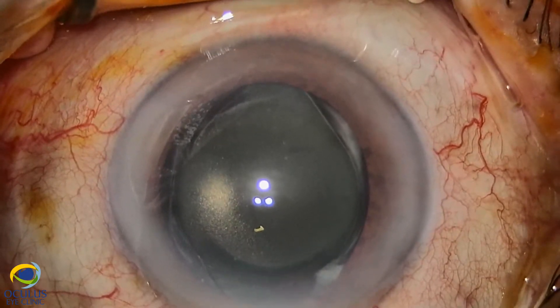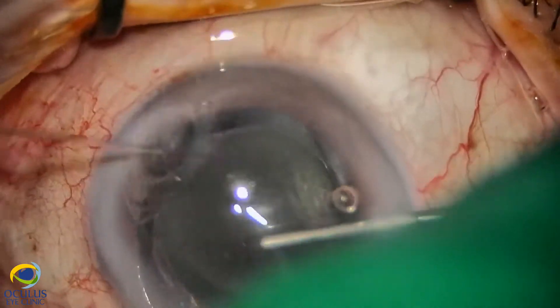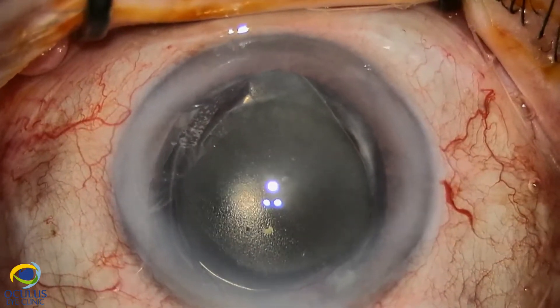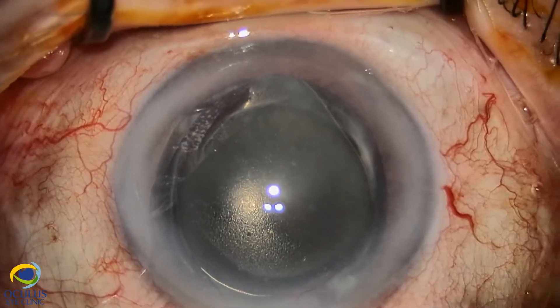Hello, this is Dr. Rozana Moraru from Oculus Eye Clinic, Bucharest, and I'm going to present you a case in which we needed to explant an opacified IOL and to implant a new posterior chamber IOL.